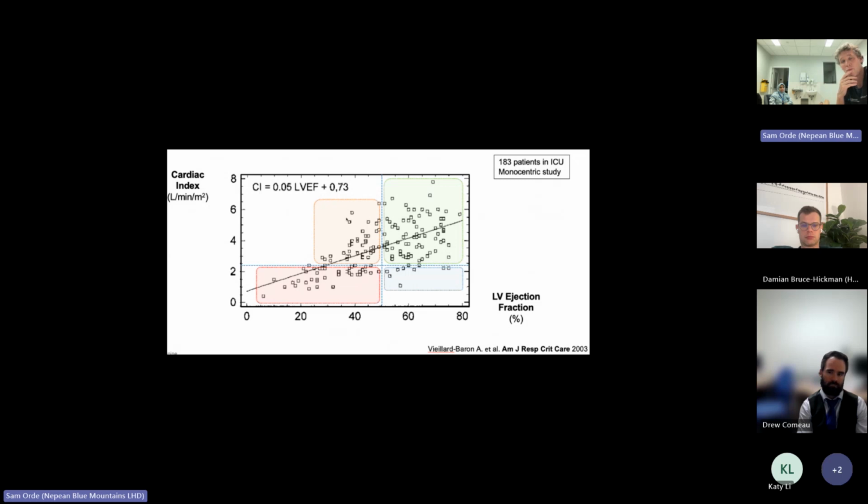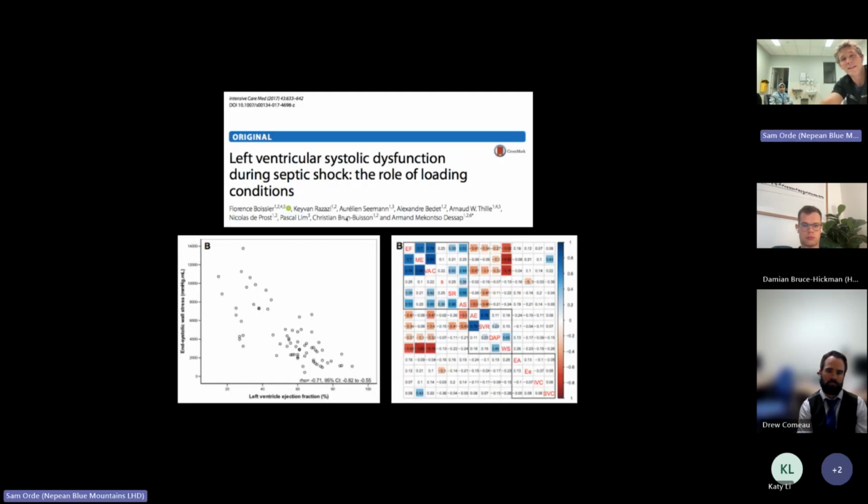And I guess what it can be useful for is maybe talking about, I'll talk about this again in a second, some of how the VA coupling potentially is working, maybe. Anyway, that's what this is trying to show. So in terms of talking about VA coupling, I guess what ejection fraction can try and help tell you is how well those two things are combining.